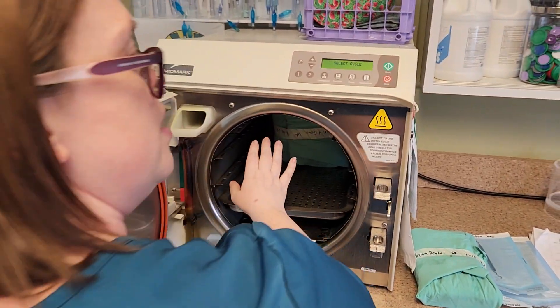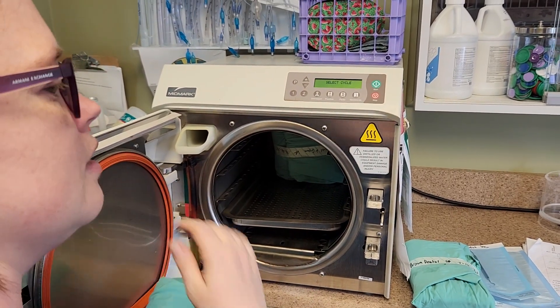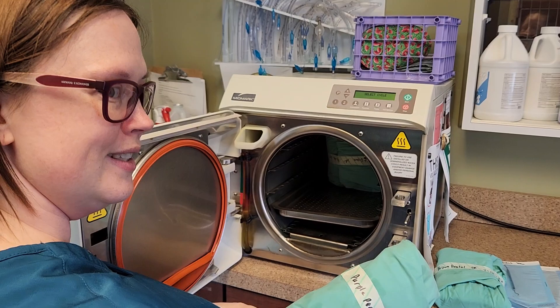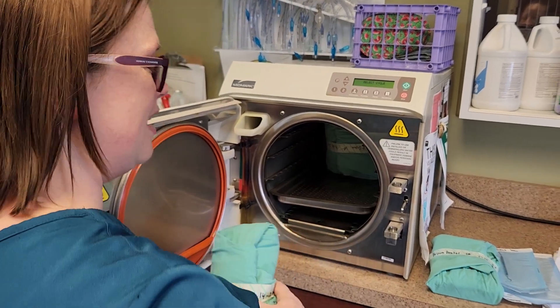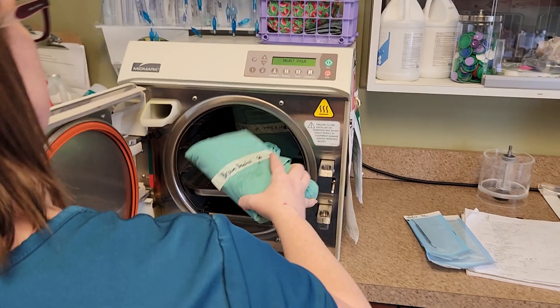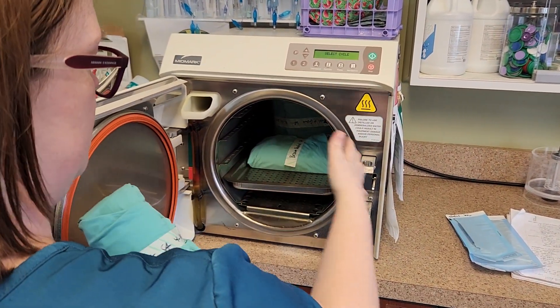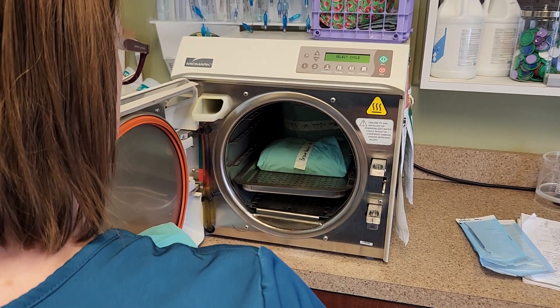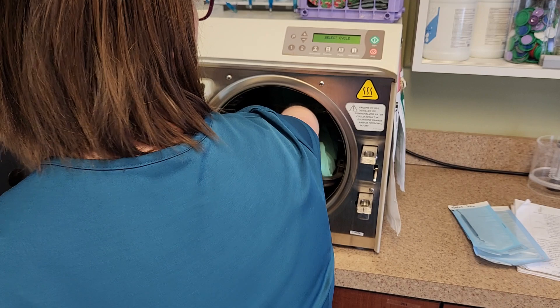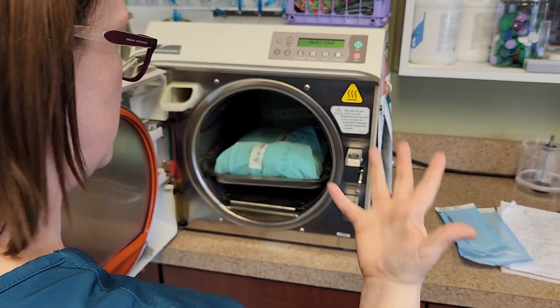I'm going to set it at the bottom so it's not touching the top. I'm going to push it back, but not so far that it's touching the back of the machine — because if it touches the back, it's going to burn the wrappings and make a foul smell. Again, you want to make sure it's not touching the sides either. I'm also leaving a little bit of space in between them so the steam can circulate and do its job.